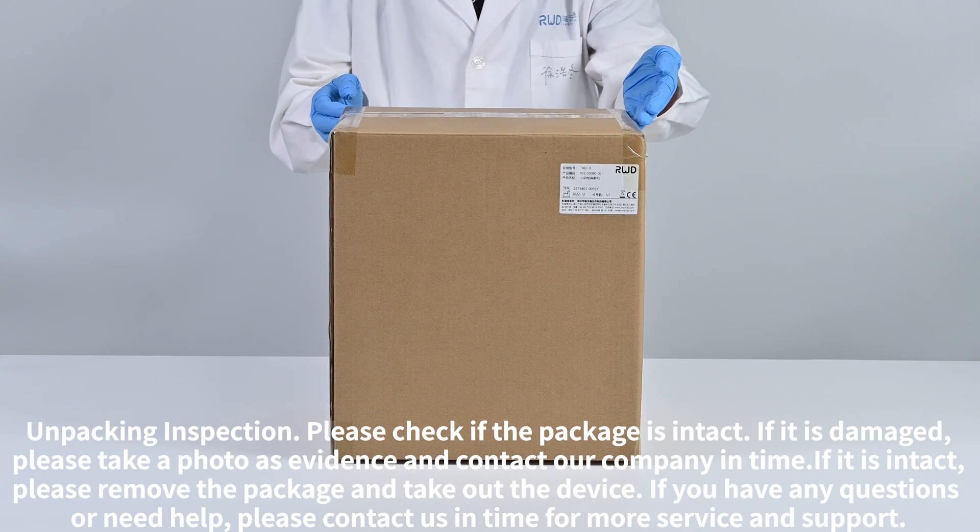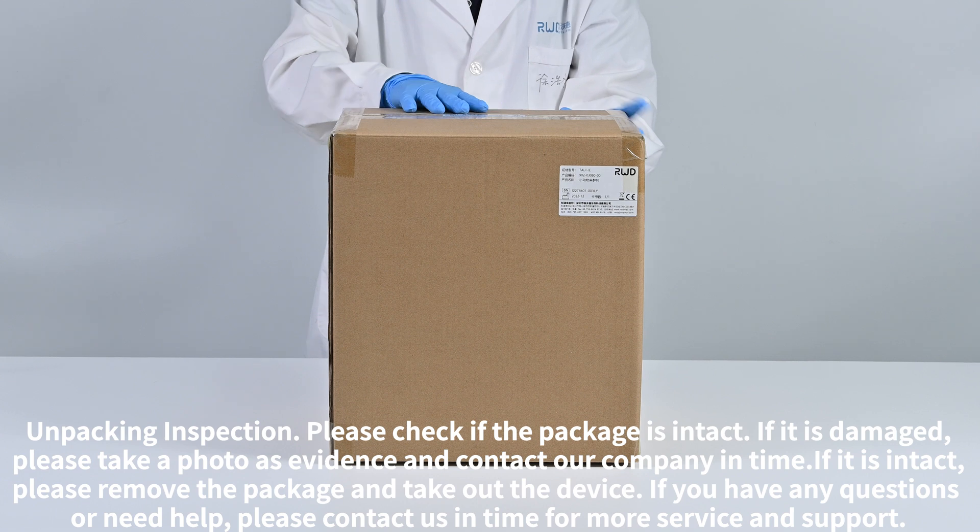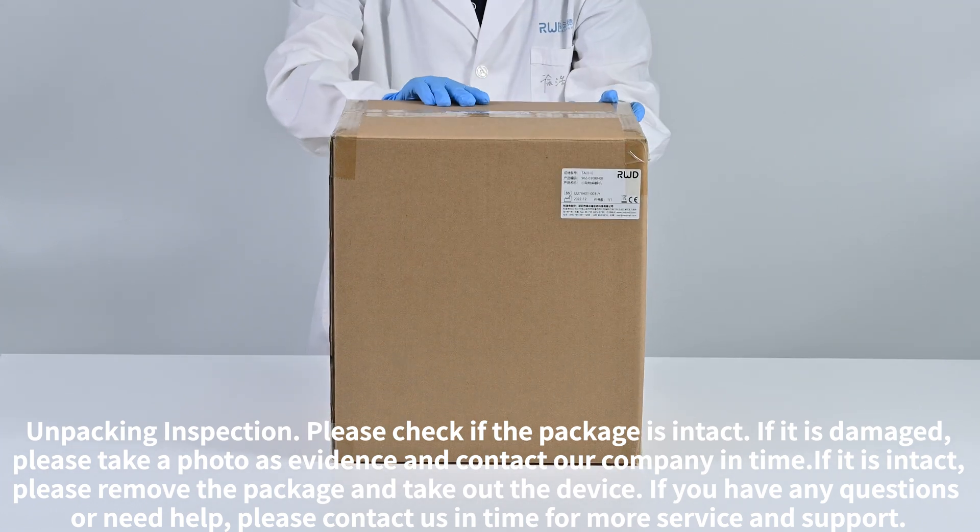Unpacking inspection. Please check if the package is intact. If it is damaged, please take a photo as evidence and contact our company in time.